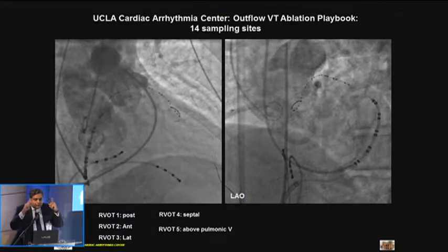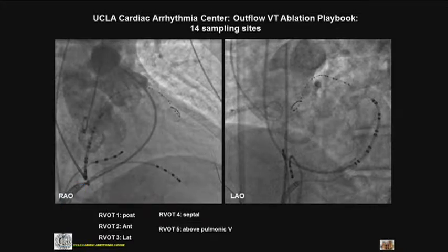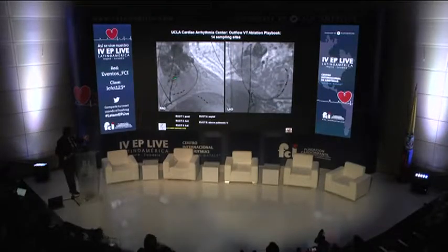So how do you now relate this image in the EP lab when you're looking RAO, LAO? Here's an example where we have done dual power injections. This is injection into the PA, and this is a pigtail injecting in the aorta. So it's a dual injection. This is RAO, this is LAO. So this is the plane of the septum. And of course, all this is atrial, this is ventricular. So you're looking at the interventricular septum directly face on. This is his RV catheter.